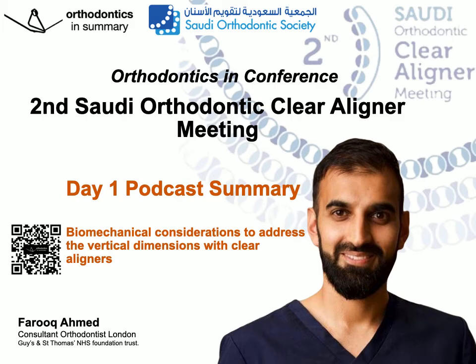For this, this is where we have retraction of the dentition taking place and therefore relative extrusion at the same time. What he described is that aligners do not extrude along the long axis of the tooth. What aligners actually do is they push on the labial face of the tooth and they push the tooth lingually, and it extrudes as a consequence of that process. So actually, when we are retroclining, we are essentially extruding at the same time. He described case selection and how dental anterior open bites are more predictable than skeletal open bites. Described using extrusion of the anterior teeth and also retracting those anterior teeth in a synergistic fashion.